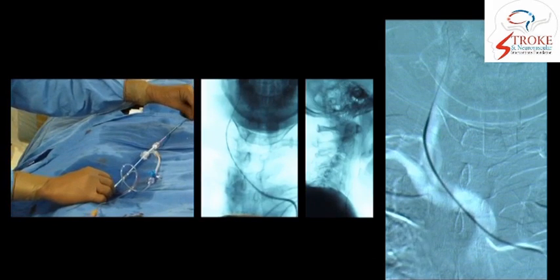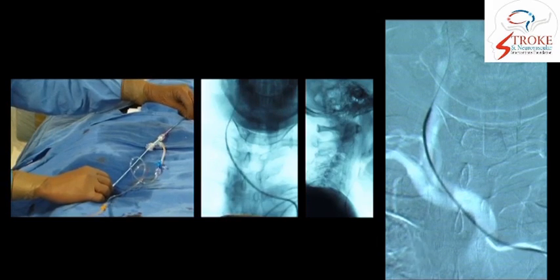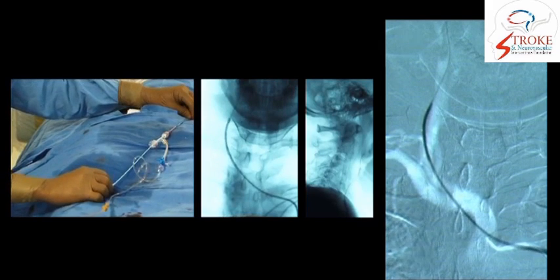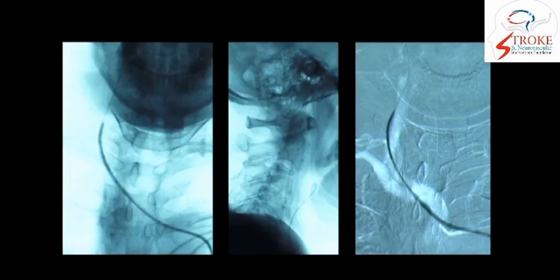You should realize there are always plaques in this patient, in the aorta and even the access arteries. So the use of a coaxial system prevents any embolism during the guide catheter or a long sheath placement. The guide catheter is in place.